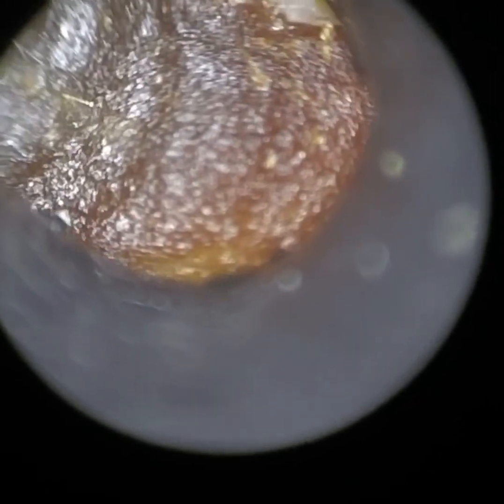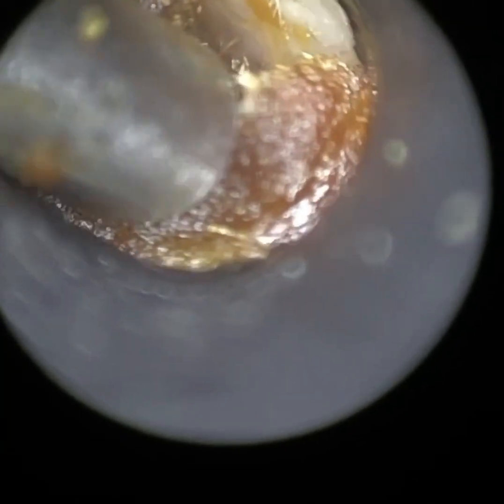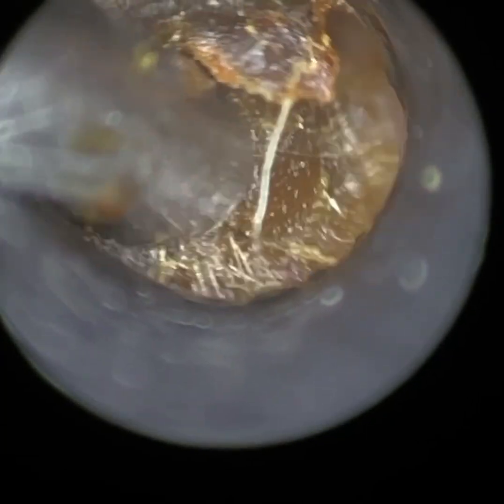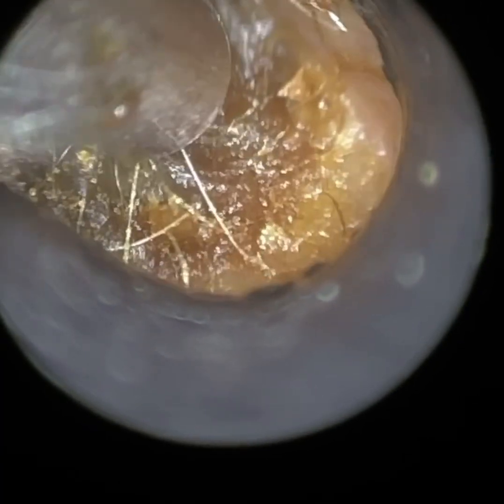This is the patient's right ear, and I'm having to really, really stretch this — it's a bit narrower than the left ear. And again, you can just see how clear the image is, how in focus both the wax is and also the suction probe.